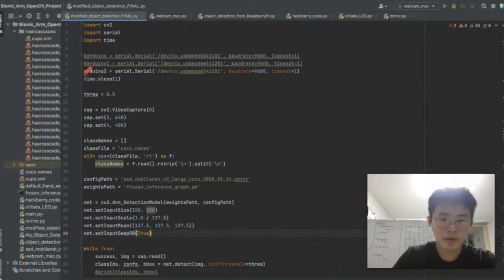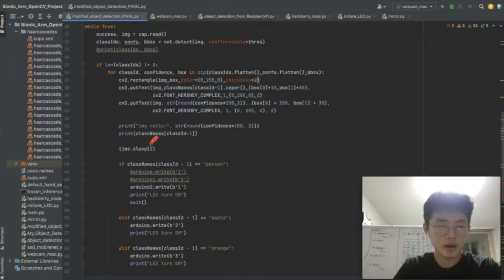For the Python code, I first made a serial connection to the Arduino Uno that is connected to the Raspberry Pi. Weights and configuration files are also referenced as well. Basically, the code identifies and draws a red rectangle around the object detected continuously in a while loop. Depending on the object, the code also communicates specific binary data to the Arduino serial port. For example, if an apple is detected, the binary number 2 is communicated. An LED is lighted up as well to show visual evidence that the code is working.